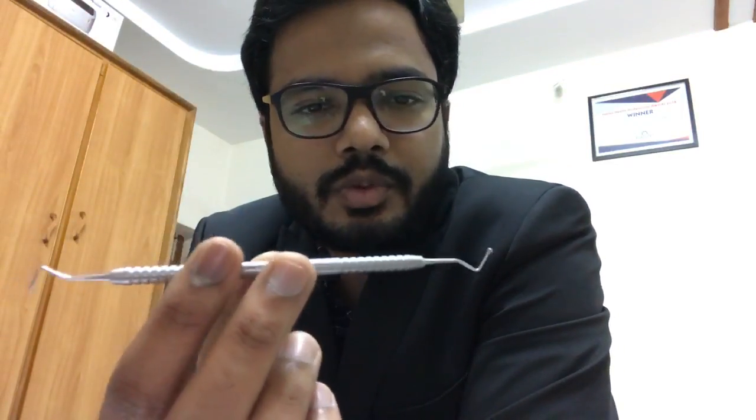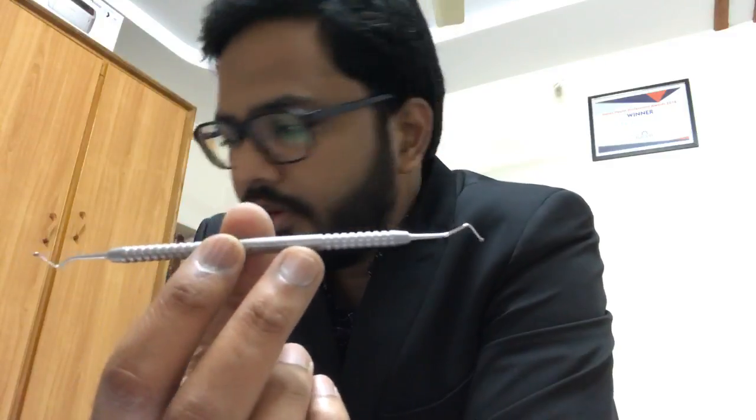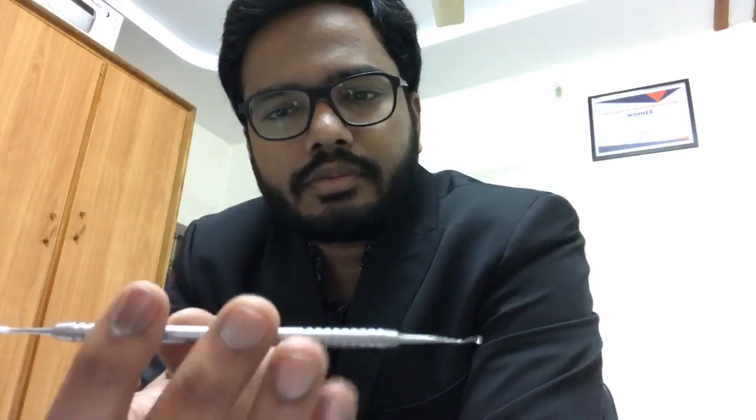So this is a spoon excavator, a double-ended instrument used for removing soft caries, and also for carving amalgam and for carving wax patterns, as given in literature. It can also be used for carving amalgam and direct wax patterns. Okay, so that's a spoon excavator. Fine.